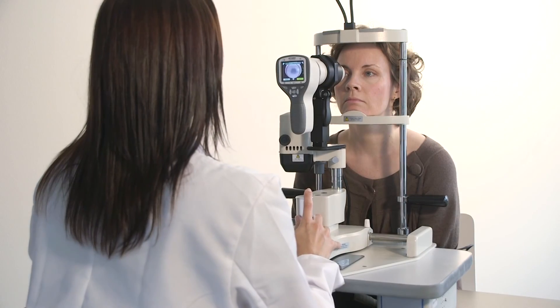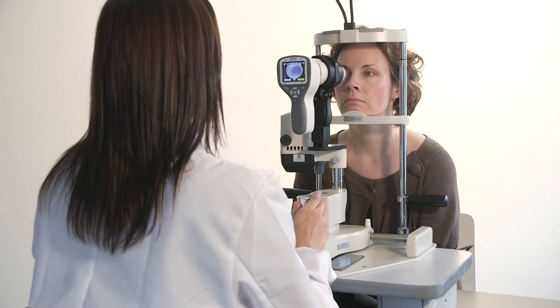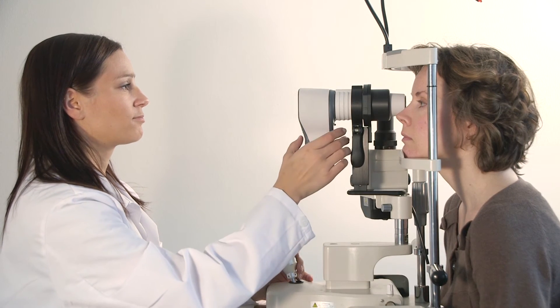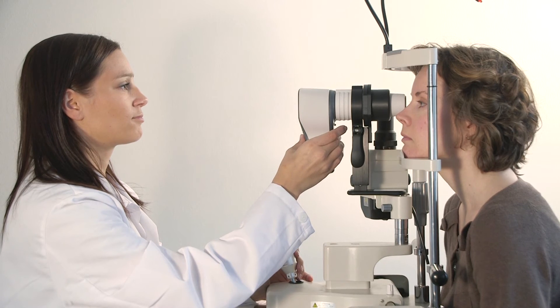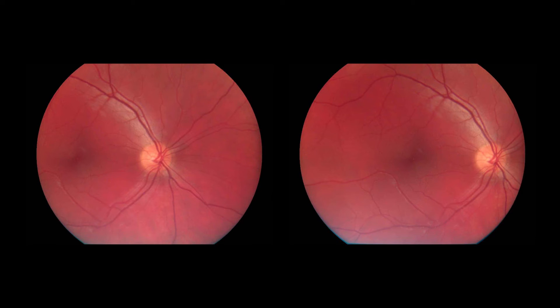The SmartScope can also be mounted on a slit lamp stand with a special adapter. This will give ultimate stability for imaging as the patient's head is secured, enabling the sharpest possible images. In order to ensure a good quality examination, take multiple images. By trying different illumination and focus levels, you can find optimal settings for each patient.